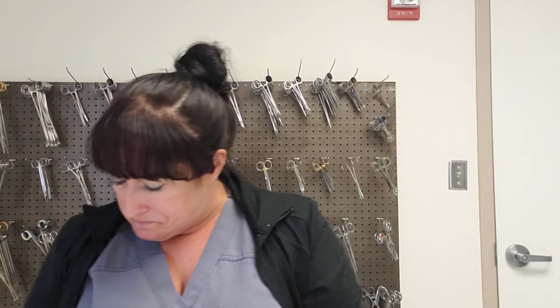These are going to be scissors that you're going to have on a lot of your Mayo setups. A Mayo, which you will learn soon, is a little table, I guess, that we use to put all of our very important instrumentation on. We keep it in front of us so that we can hand things to the surgeon and have everything ready instead of having to go to our back table all the time and turning our back to the sterile field. We want to do that as little as possible. All right, moving on. So there are so many other scissors. We'll just focus on a few more.